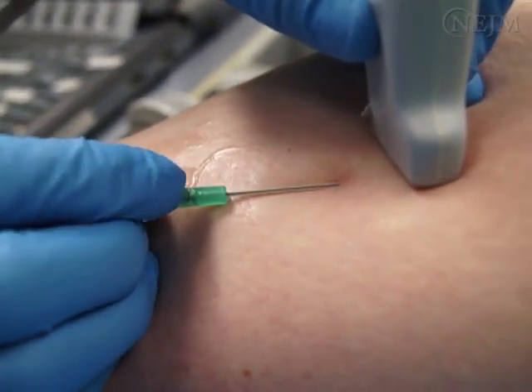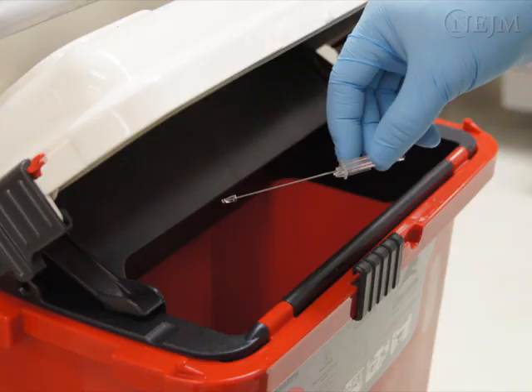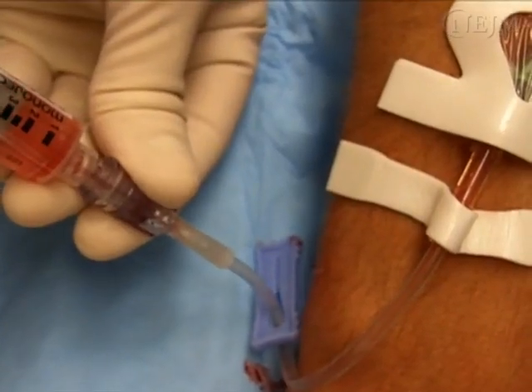Hold the needle still and advance the catheter into the vein. Remove the needle and place it into a sharps container. Remove the tourniquet. Anchor and flush the catheter as previously demonstrated.